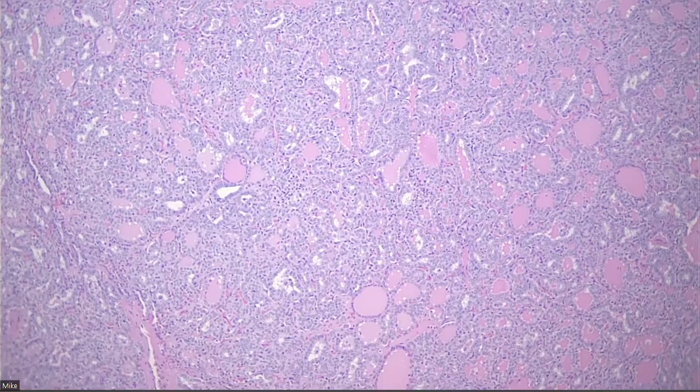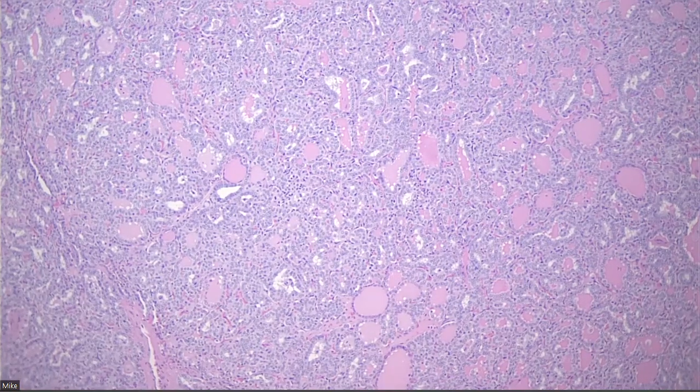It is thought because historically patients with BRAF V600E did worse than patients without it. I'm skeptical, because I don't know how many papillary carcinomas were diluted in our historic data by what is now NIFT-P, which in the past was called PTC follicular variant.